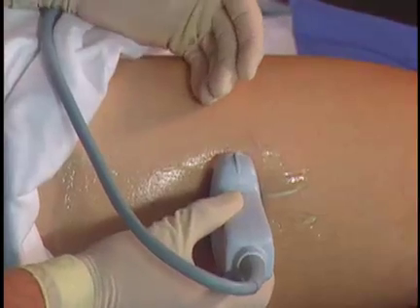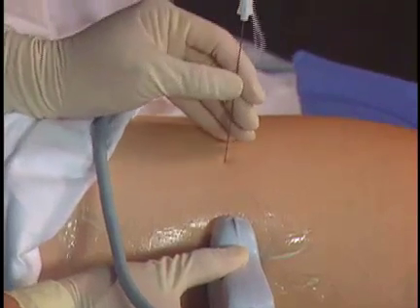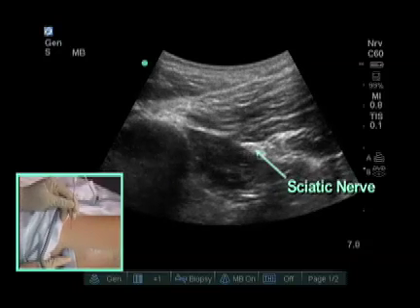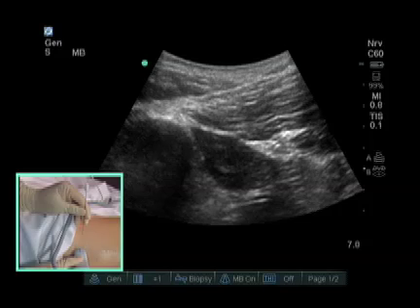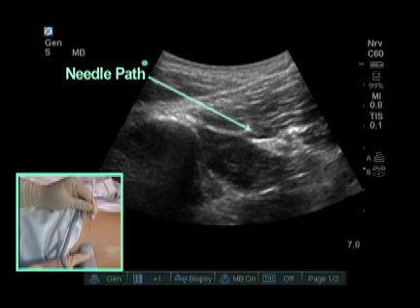Needle approaches for the sciatic nerve block, whether at the mid femoral region or higher up at the subgluteal region, are performed from a lateral to medial approach. This usually starts three to four centimeters away from the probe. Higher up we use the same needle approach. We can see the triangular sciatic nerve and start the needle at that angle. I typically put the nerve on the distal side of the screen from where the needle is entering, in order to see the needle better as it travels across the screen to the nerve.